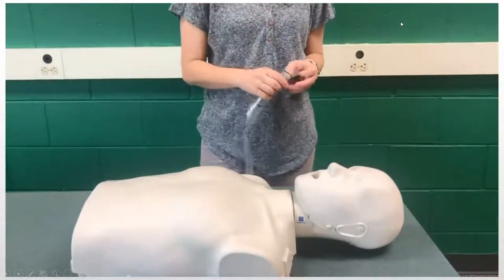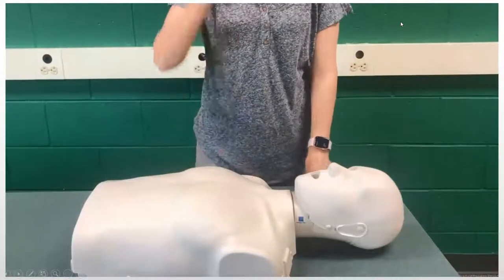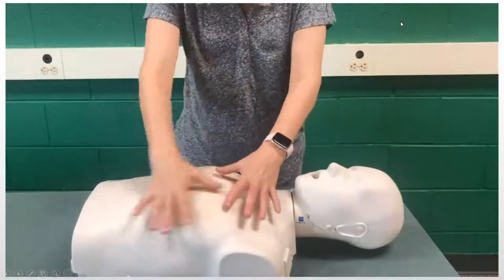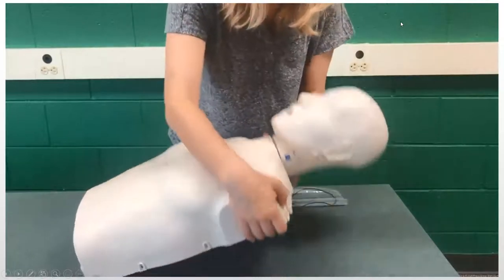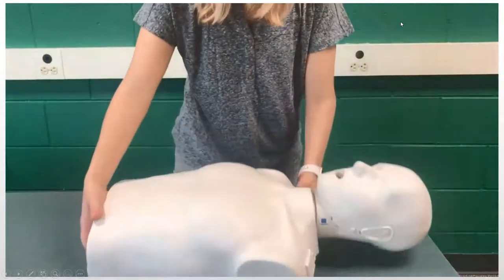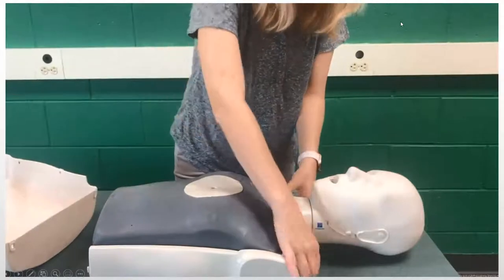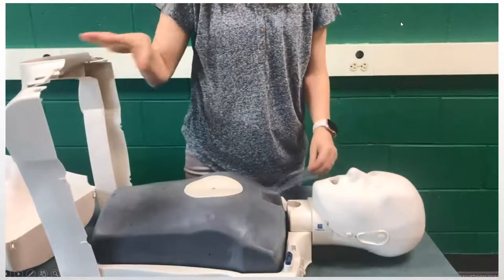I'm going to show you how to put the lung bag into the Preston CPR mannequin. This one has the heart rate monitor and also the jaw thrust component. The first thing that needs to happen is the entire top section or chest piece needs to come off. There are a whole bunch of small tabs — 10 of them — that you have to unhook. You've got to remove that before you do anything else.